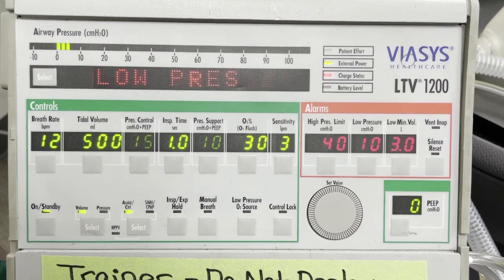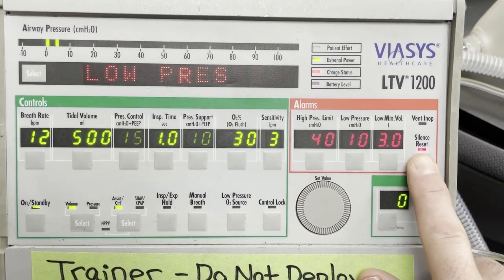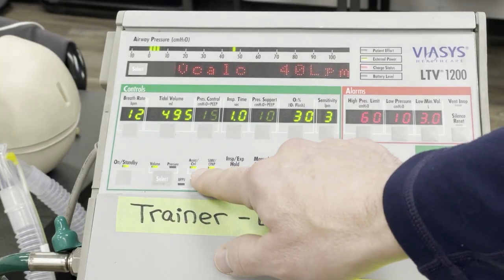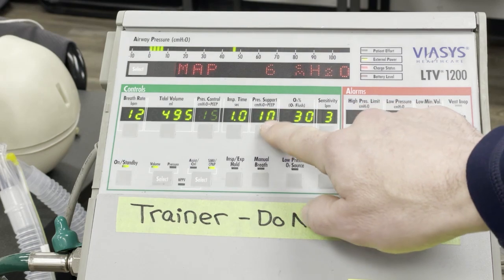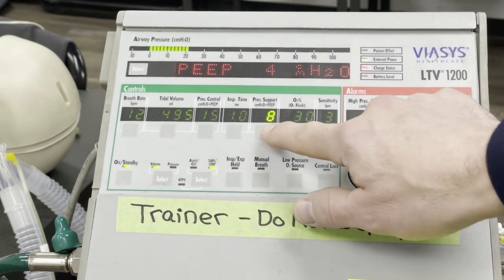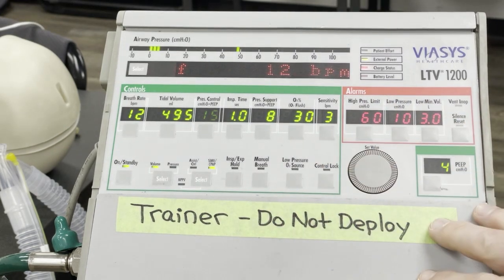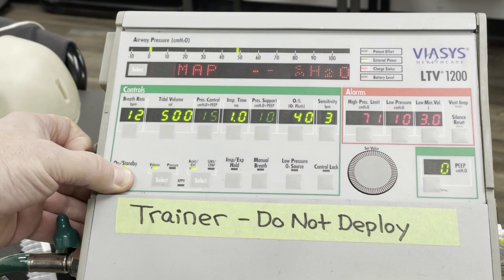Now you can dial in the rest of your settings. To enable SIMV mode, you will need to toggle the button until the mode is lit with a solid light. Ask respiratory therapy to look over your vent settings and alarm limits to confirm they are all correct. Now you can shut off the ventilator until you are ready to connect to the patient.